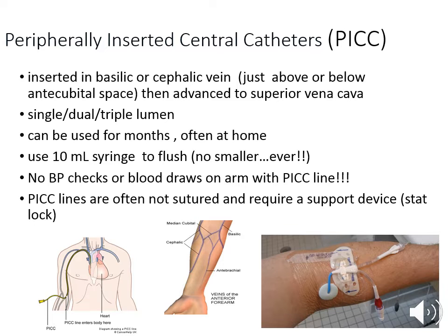And then PICC lines are often not sutured, but require a supportive device, a stat lock. So you'll see they'll come with Foley catheters too, very similar. That just keeps it inserted more securely.